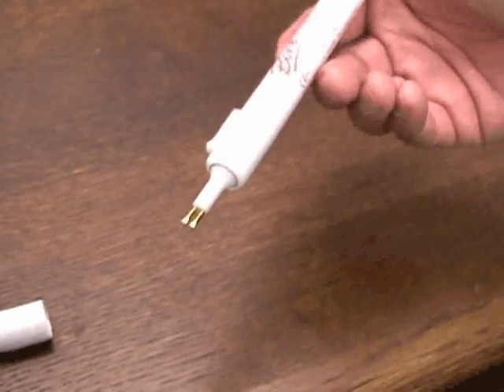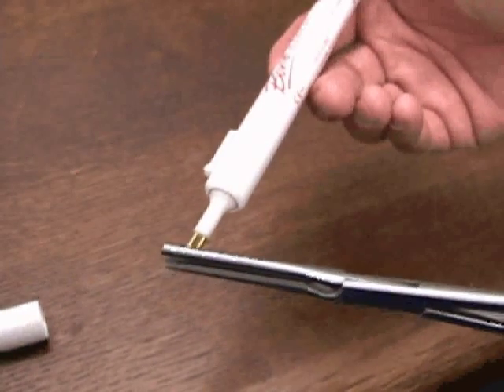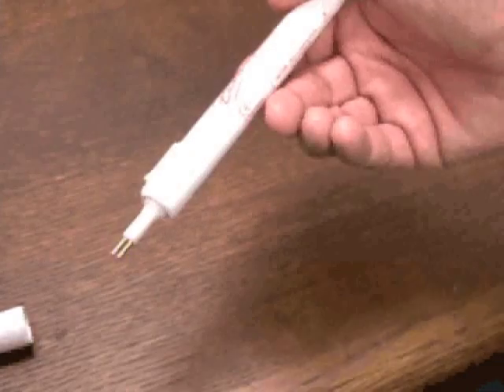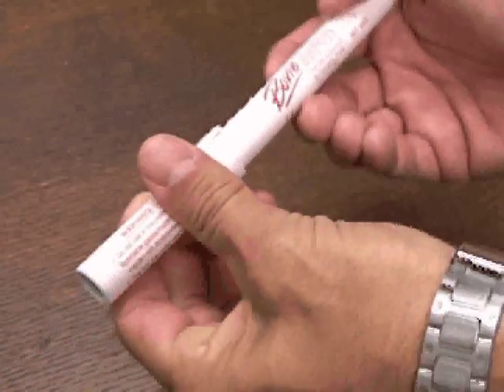To properly dispose of the cautery, use hemostats to break off the tip. Replace the safety cap and dispose of the cautery and tip according to facility procedure.